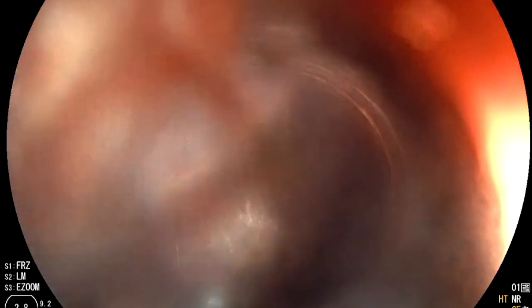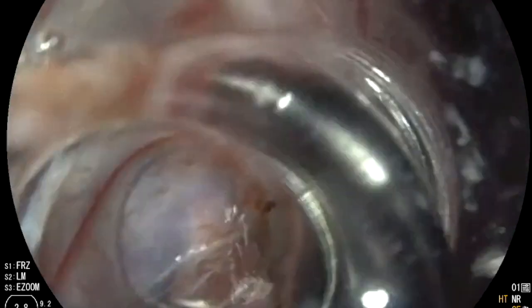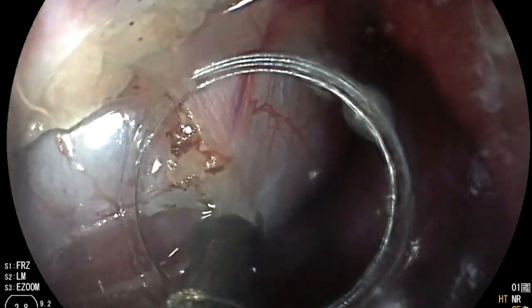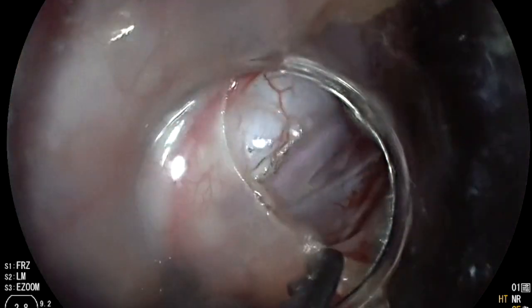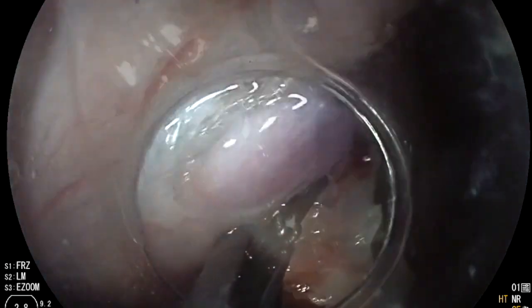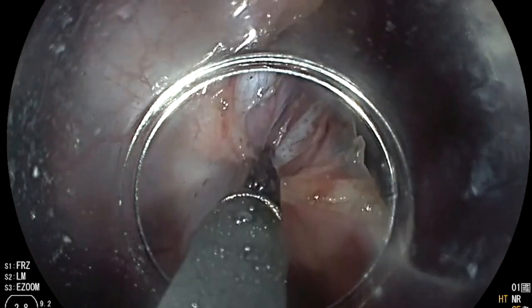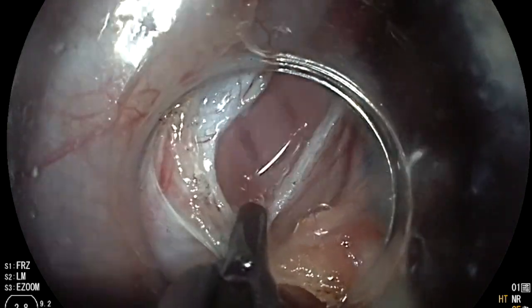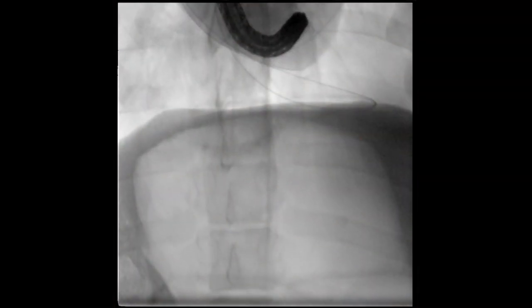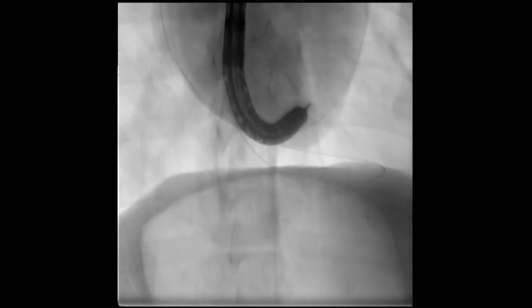Bleeding was encountered during the dissection, which was easily controlled with cautery. This is important to demonstrate, as even incidental bleeding that may be encountered can be safely controlled endoscopically. This fluoroscopic video of the pericardium after completion of the pericardial window shows no residual CO2 or contrast left within the pericardial space.